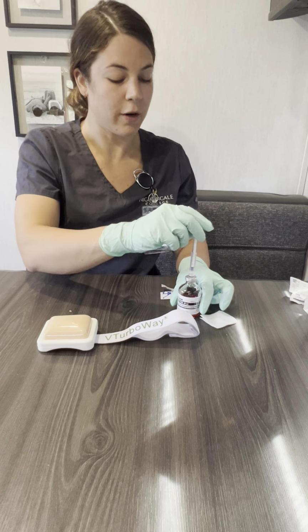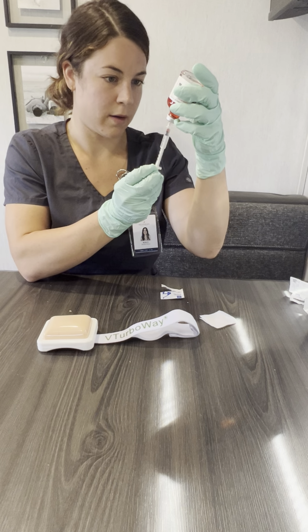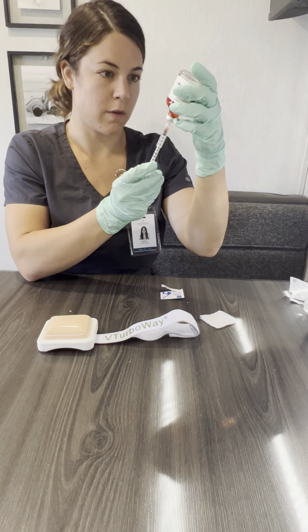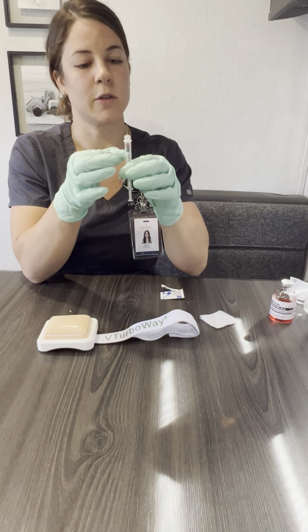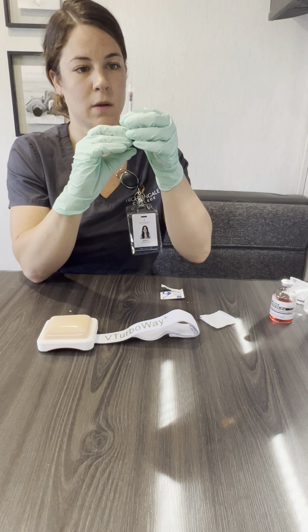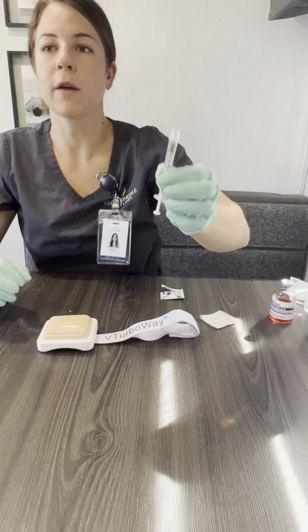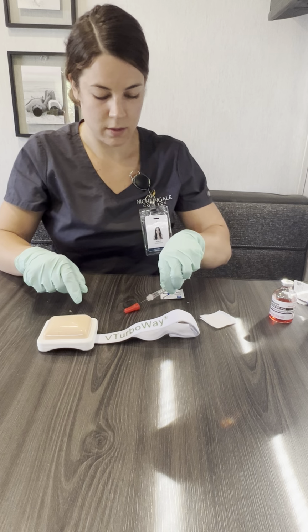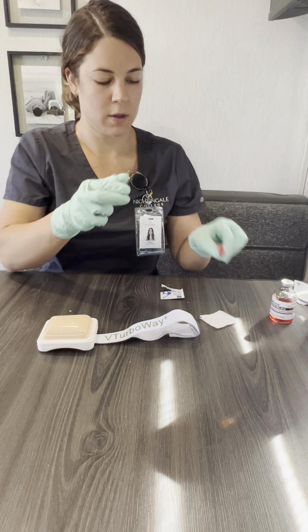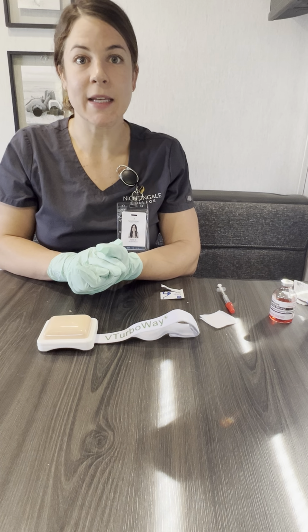I am then going to flip this over and withdraw 0.1 ml of tuberculin. I'm going to make sure there's no air bubbles. Perfect, so it's 0.1 mLs. Once I have done that, I'm going to carefully recap and set it down. I'm then going to go ahead and get the site for injection ready.